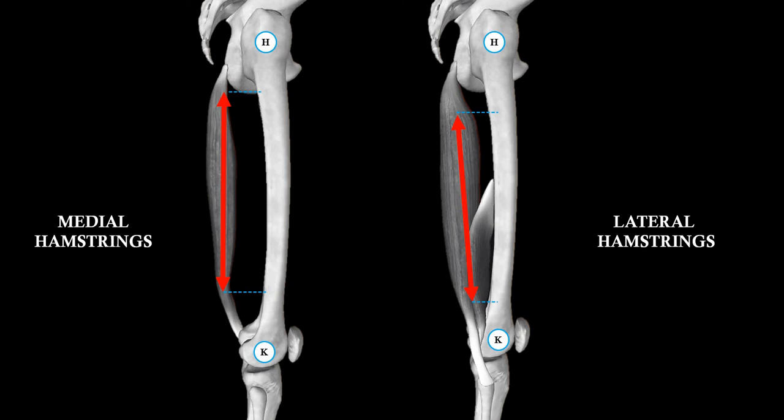We simply didn't because you've got to learn about it first. So global recording of muscle activity, question mark I'd have next to that. It's not invasive, unlimited recording time, reproducible, and it combines very well with other techniques. But it's by no means the only technique out there that you can use, so that's something to consider.